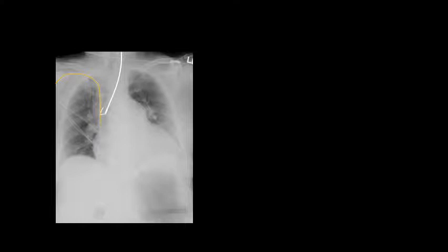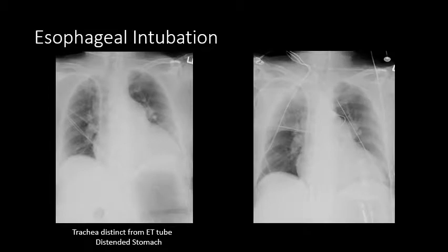Here is another interesting example. We have a subclavian line, and we can see the endotracheal tube outlined by a thick white line. Interestingly, the tube appears to project lateral to the trachea. We can also see in the lower corner of the image a markedly distended stomach. This represents esophageal intubation. After repositioning, we can see the catheter following the course of the trachea and terminating above the carina in good position.